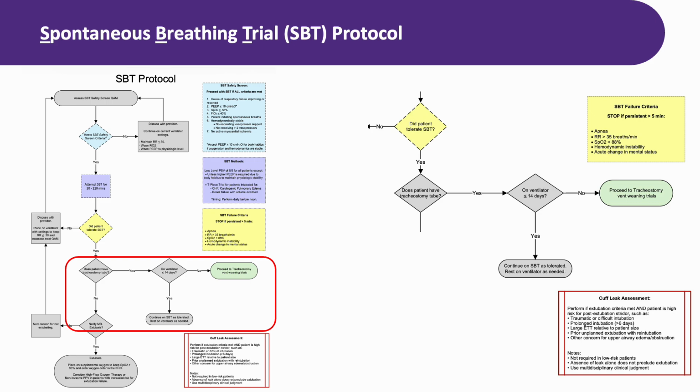For patients who proceed with the SBT, you monitor them throughout the 30 to 120 minute trial. If they fail, you document the failure criteria, return them to comfortable settings, and communicate with the team about what can be done differently. If they pass, you move toward extubation readiness assessment and coordinate with the provider.